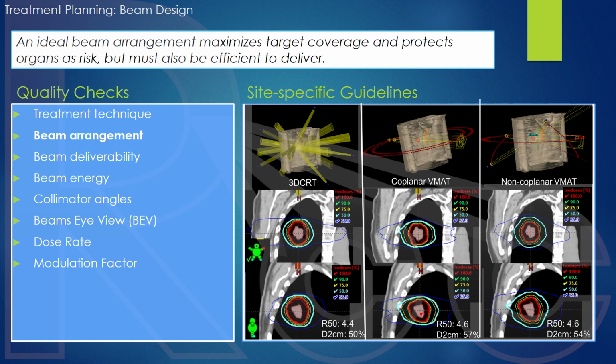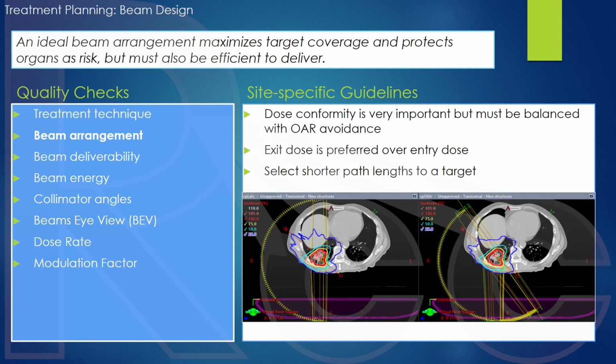Yeah, so it's really a balance between your beam conformality and your OAR dose sparing. If we go back one slide to the example in the previous slides, in this case, if you have contralateral side beam contribution, your dose distribution will be more conformal to the target. That's the advantage.